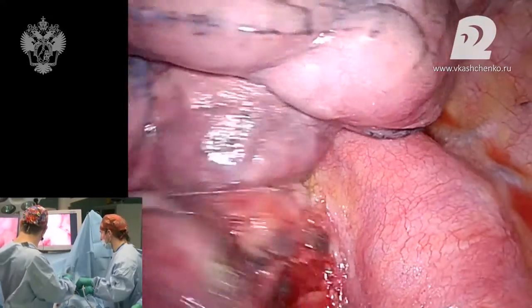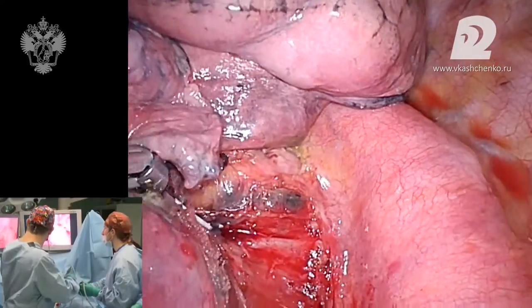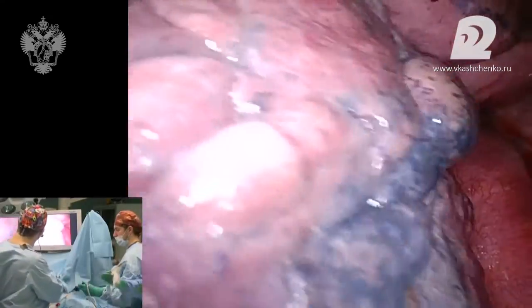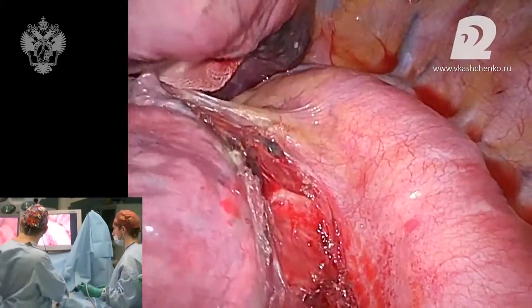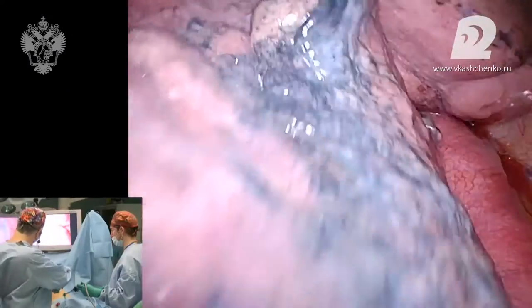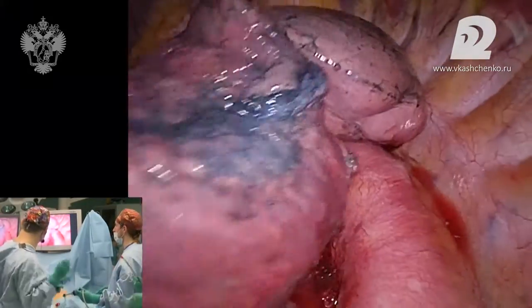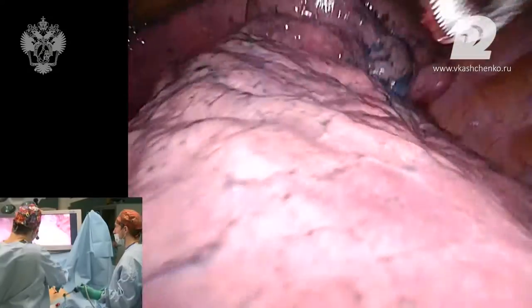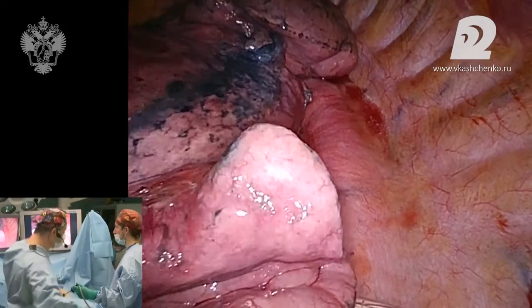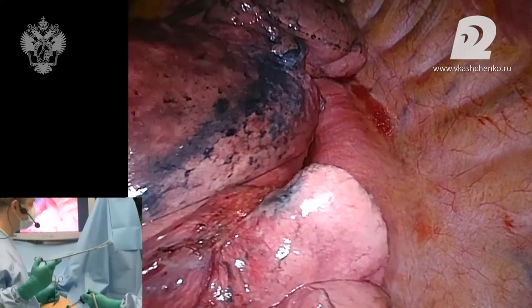A year ago, a similar surgery was performed on a patient in the supine position, with additional hermetization, with sealing. And generally speaking, Vadim Grigorievich uses tools in his surgery which are actually very similar to open surgery, but they have been adapted for endoscopy. Yes, these are American tools by the Scanlan company, and they have several articulations. These are tools with double articulation, and maybe the bigger camera will demonstrate the tools.